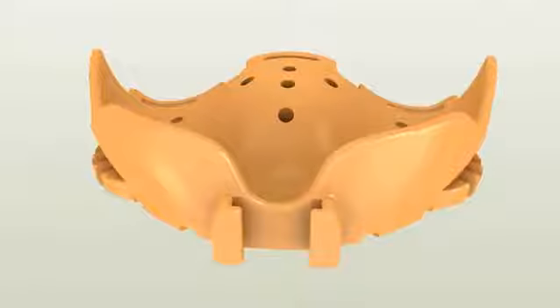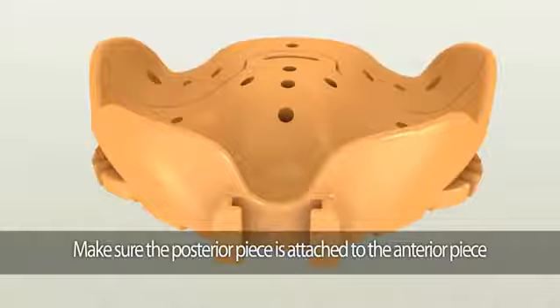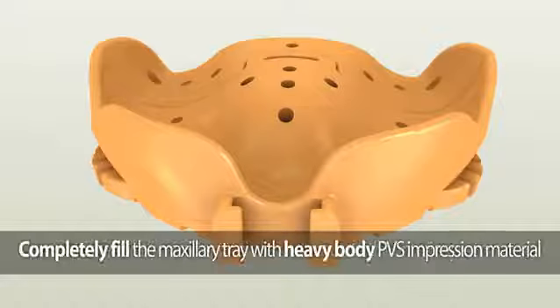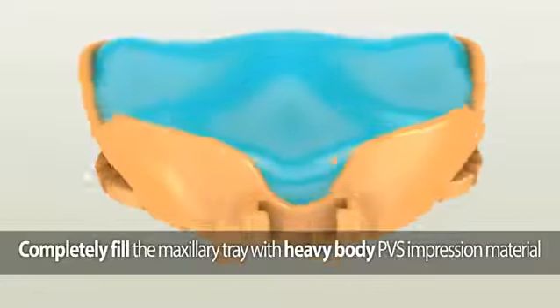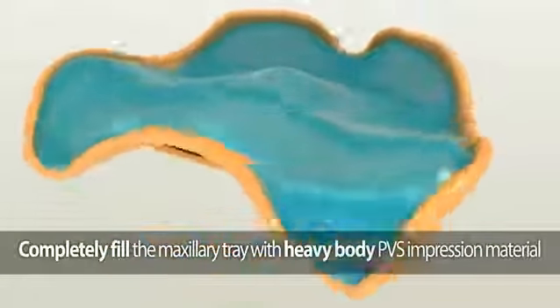Making the maxillary impression: the maxillary DENTCA tray consists of two pieces — the anterior piece and the posterior piece. Make sure the posterior piece is securely attached to the anterior piece. Completely fill the maxillary DENTCA tray utilizing fast-setting heavy or medium body PVS impression material.